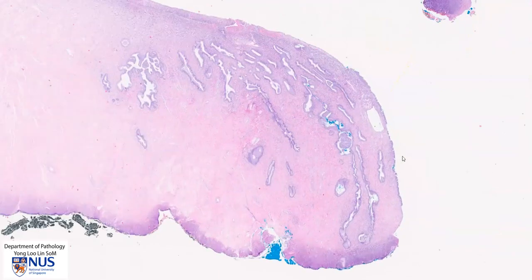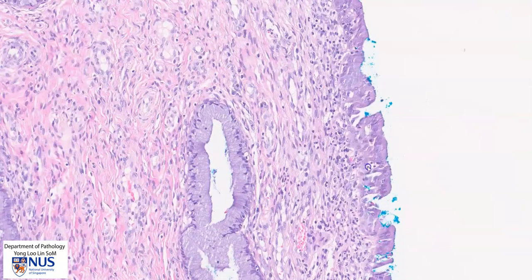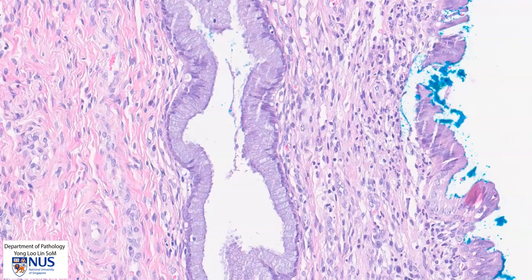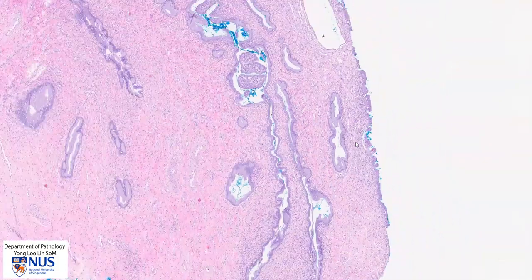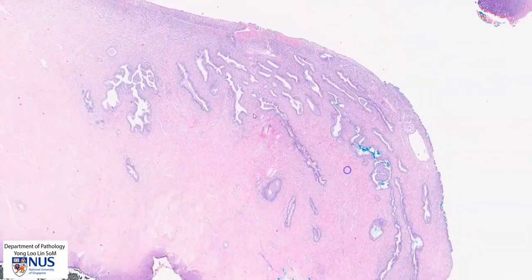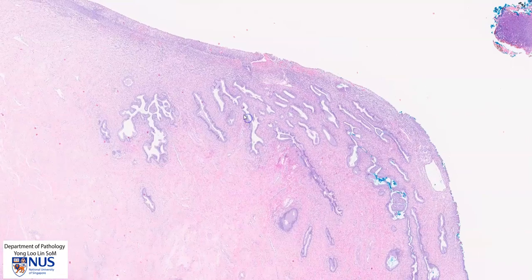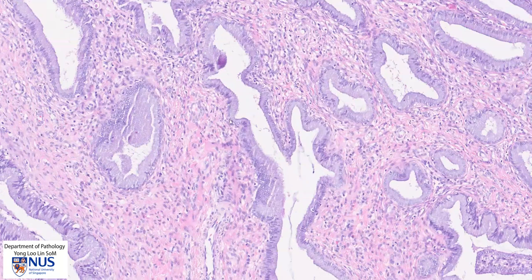Let's take a very quick look at the endocervix. We can see that it is lined by these columnar cells with basal nuclei, and sometimes the endocervical cells dip into the underlying stroma. We can see very nicely the basal nuclei and the tall column of grayish-bluish cytoplasm because it is rich in mucin. The presence of these endocervical glands dipping into the stroma is a normal finding and does not represent adenocarcinoma. We can see that the cells are all very bland with very uniform basally-oriented nuclei.